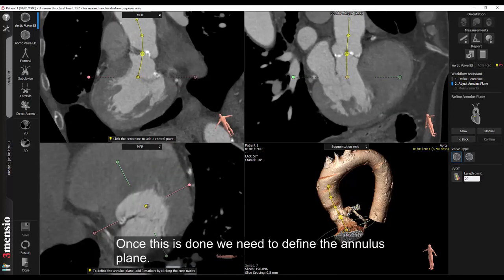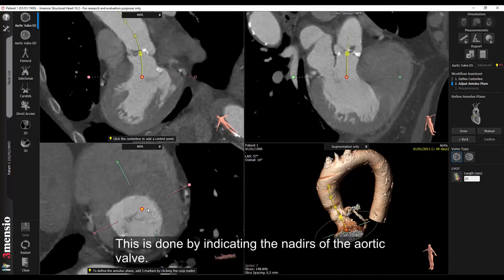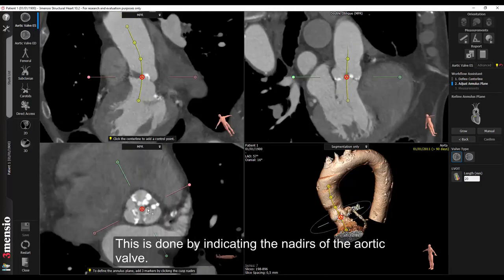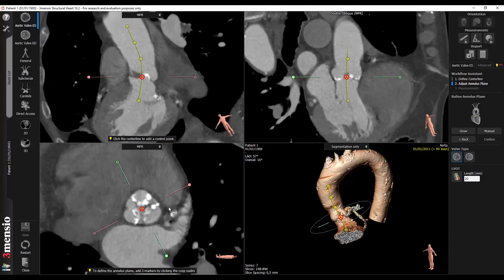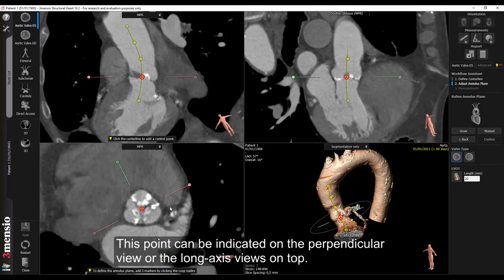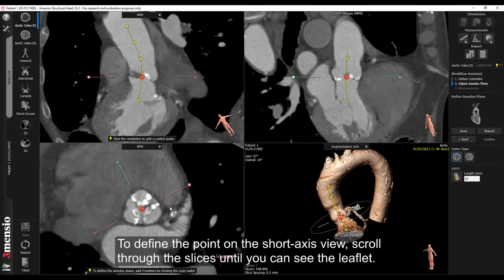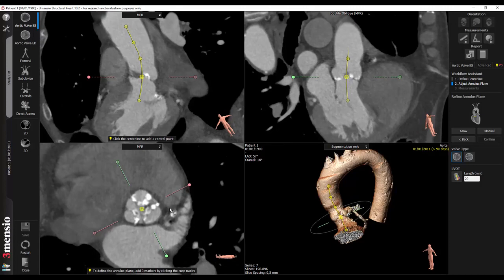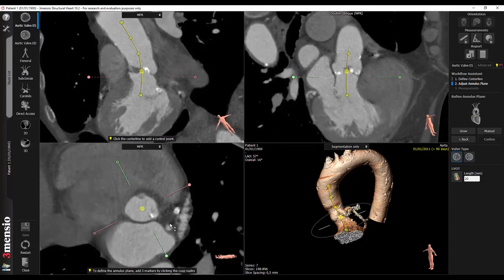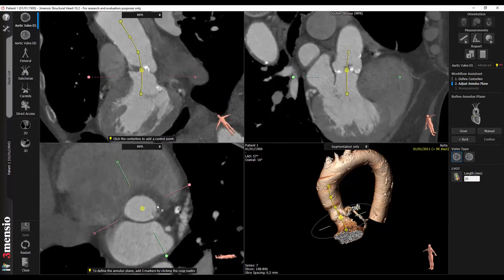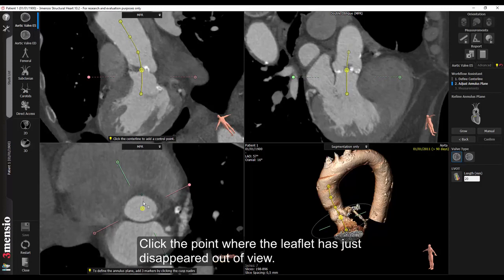Once this is done we need to define the annulus plane. This is done by indicating the nadirs of the aortic valve. A nadir is the lowest point of the leaflet or the hinge point. This point can be indicated on the perpendicular view or the long axis views on top. To define the point on the short axis view, scroll through the slices until you can see the leaflet. Follow one leaflet and scroll down as it disappears.